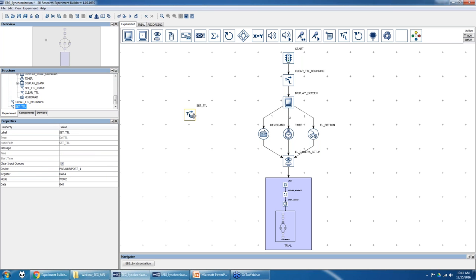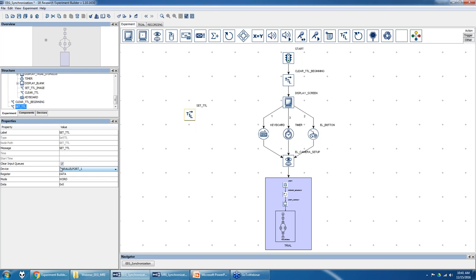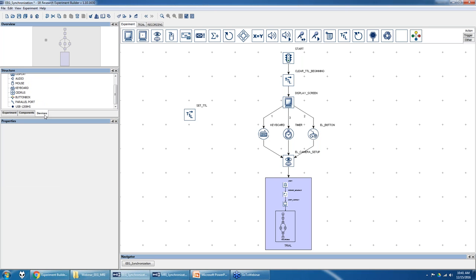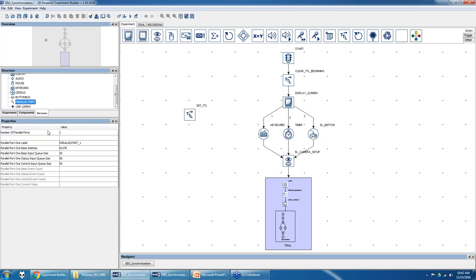Before setting up the rest of your project, go to the Devices section of the structure panel, go to the Parallel port section, and you can specify the base address of your parallel port. On any computer, the parallel port has a physical address that the computer uses to identify the hardware device. If the parallel port is built into the motherboard, that almost always has a base address of 0x378 — the 0x prefix just means the number is in hexadecimal.